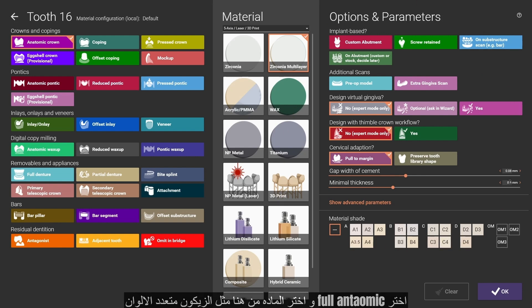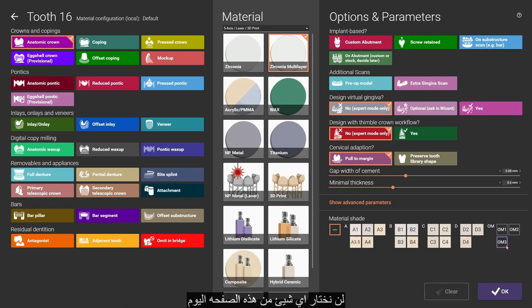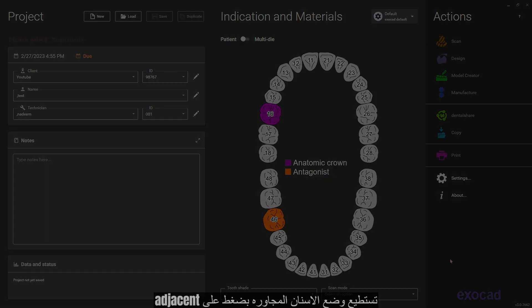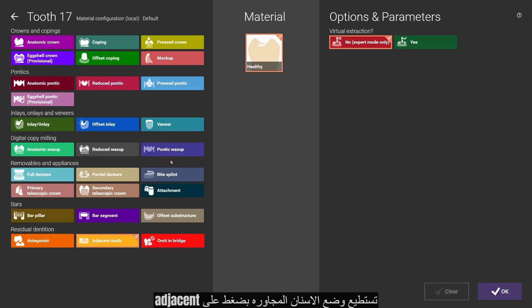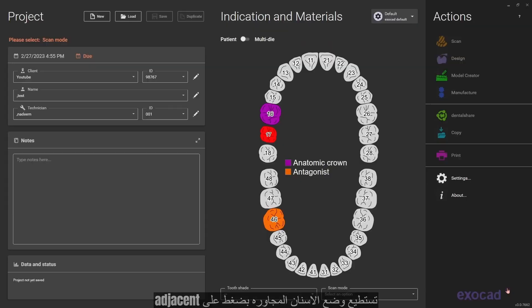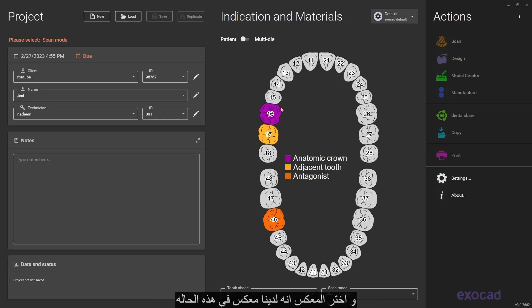We will not choose anything from this page today. You can put your adjacent teeth if you have them, and choose the antagonist to tell the software that we have two models.